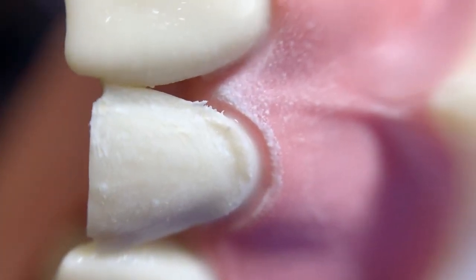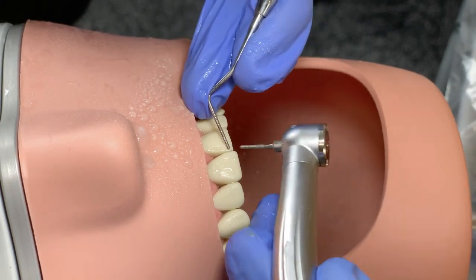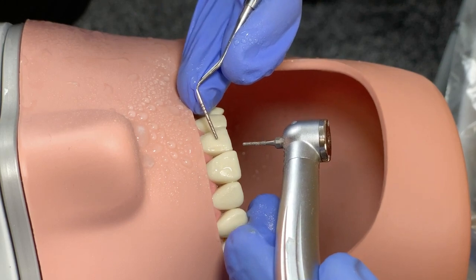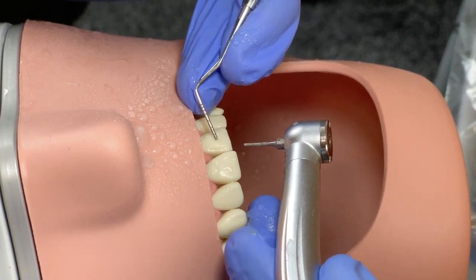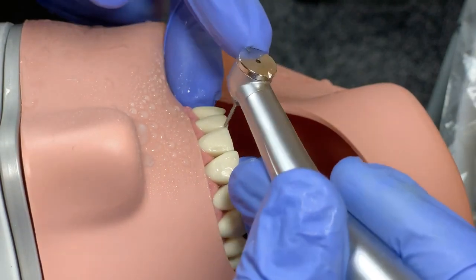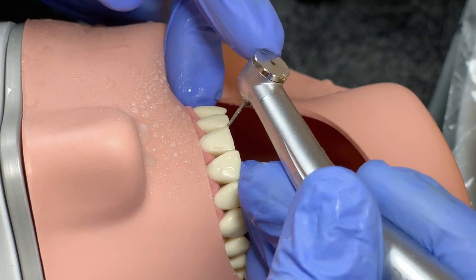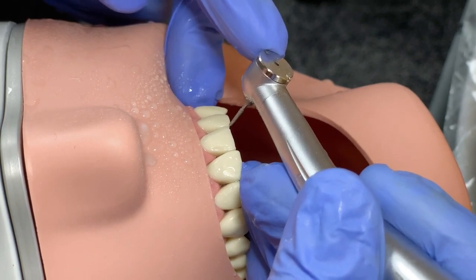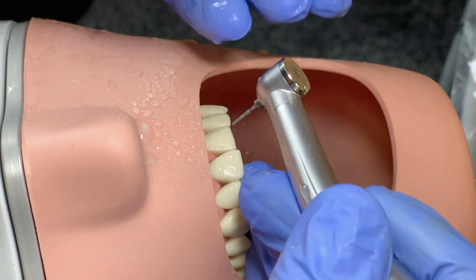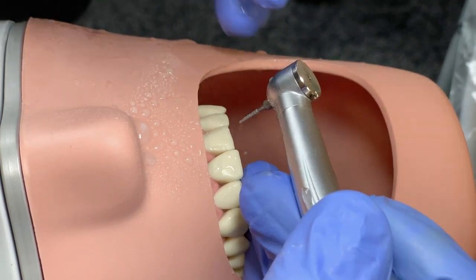Please make sure that the finishing line at the proximal points — do not make it too wide, what we call a spoon shape. This is absolutely unacceptable. That's why I say keep your bur perpendicular and don't make the finishing line wide, because if you make it wide it will be like a spoon shape and the veneer will not be fitted.